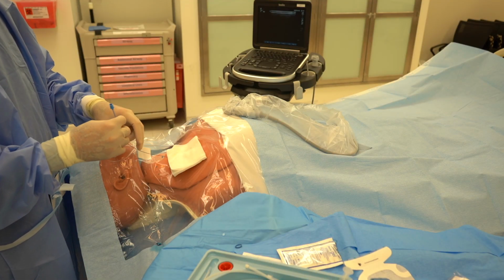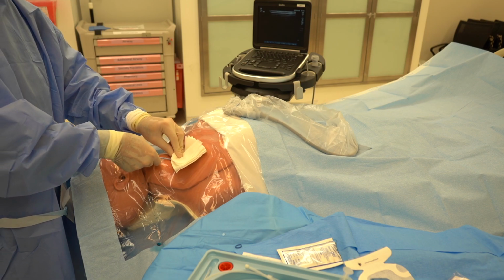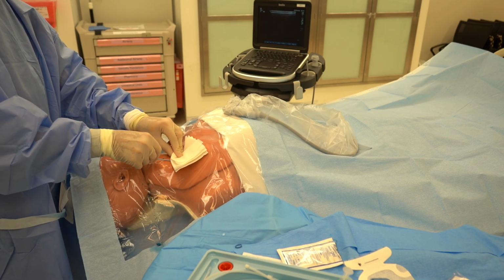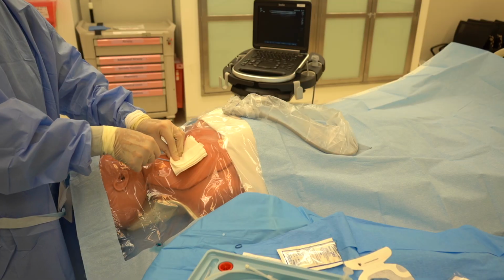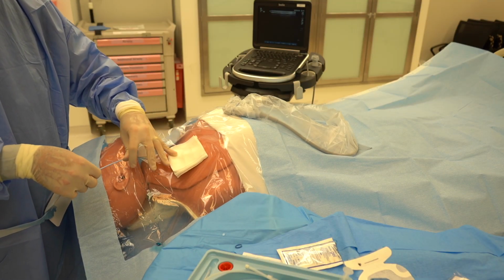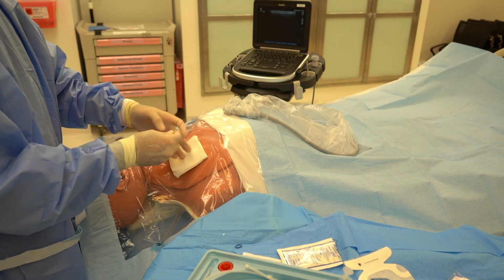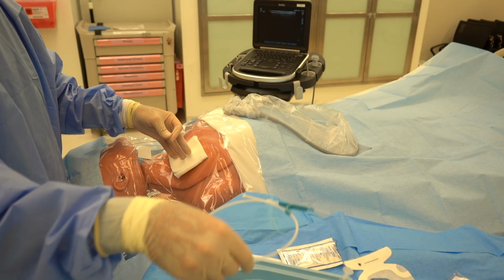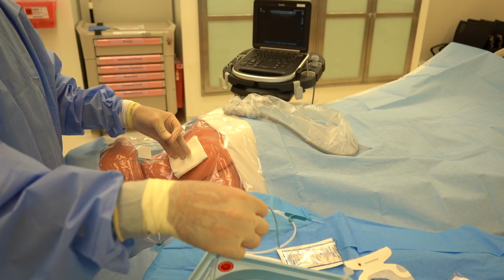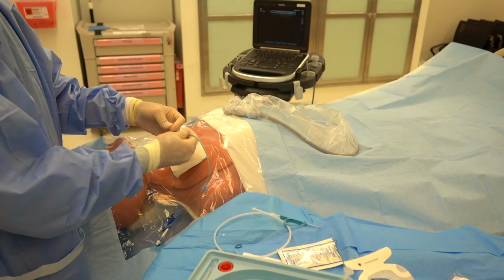Now we have our dilator. This is a single stage dilation given the gauge of the catheter is smaller. And with some force, slight rotation at times can be helpful. We'll go about halfway. We know the proper depth. We're essentially trying to dilate skin, muscle, fat, and get down to the vessel, through the vessel wall. Kind of using our hand to hold the gauze there to prevent any excess bleeding.